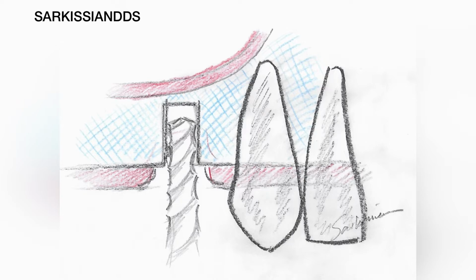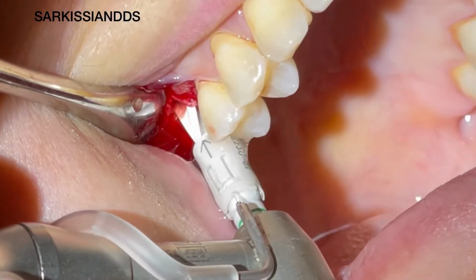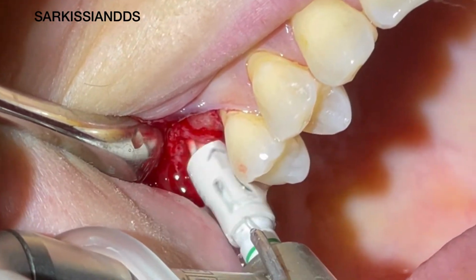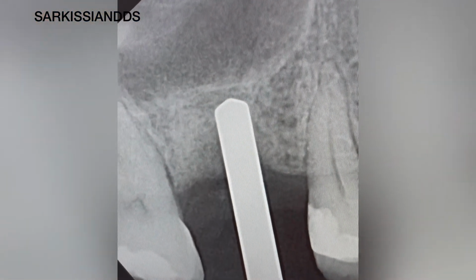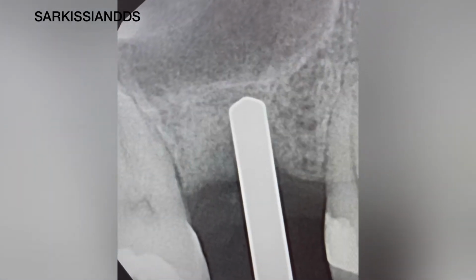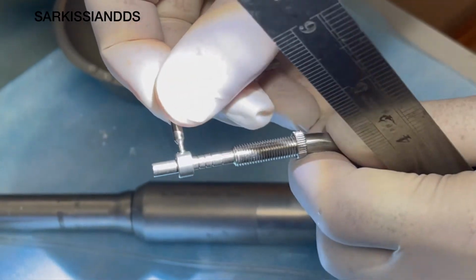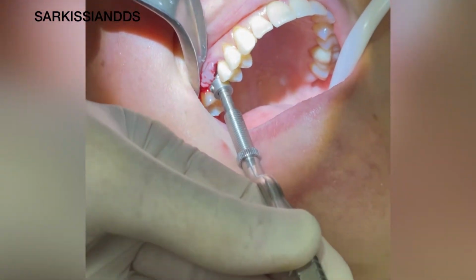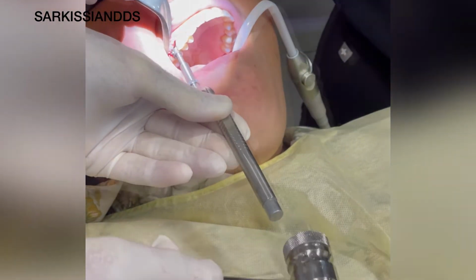After my D1 depth is confirmed, I can use my zirconia burrs from the Z-Systems kit, which gives me the luxury of one depth stop for each burr. I take one more X-ray with a thicker pin provided in the Z-Systems kit and proceed to set the bone punch to a depth of D1 plus 2 millimeters. And of course, warn the patient about the hammering that he or she is about to experience.